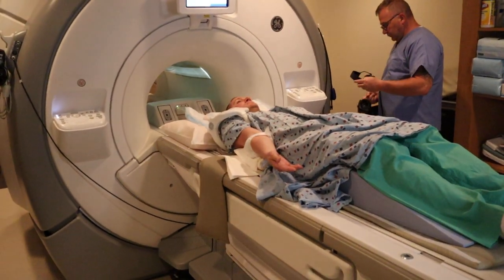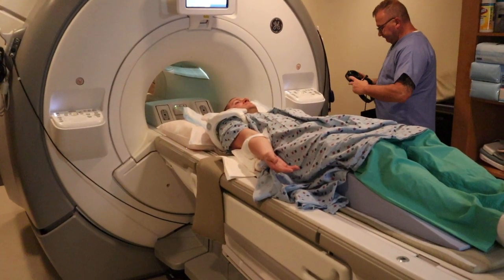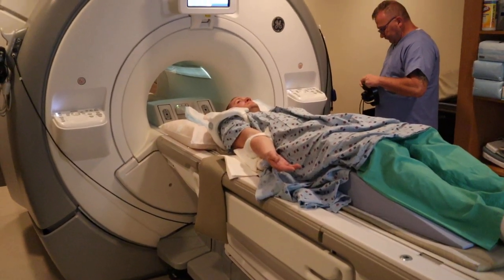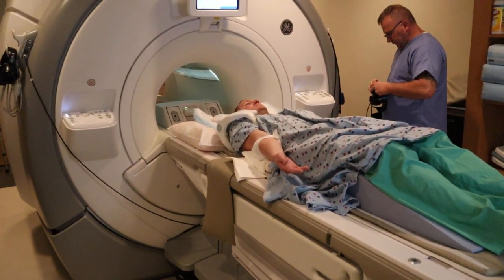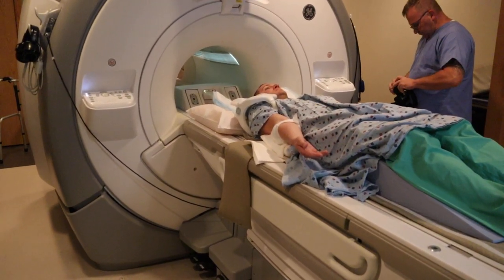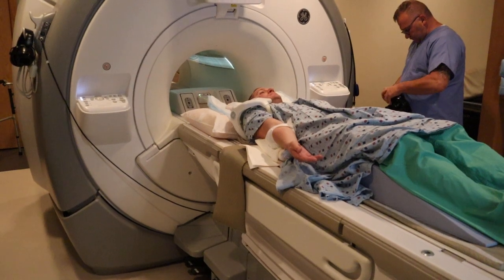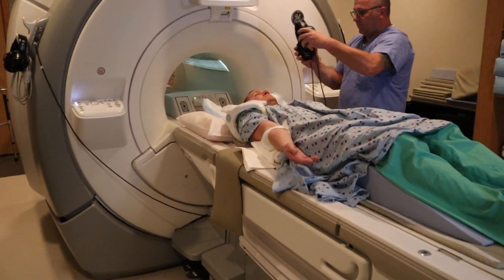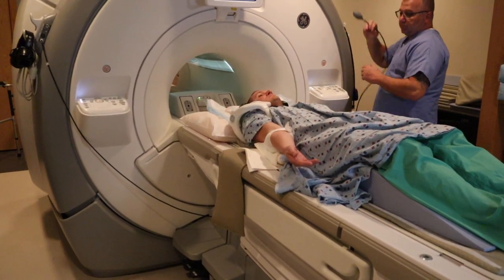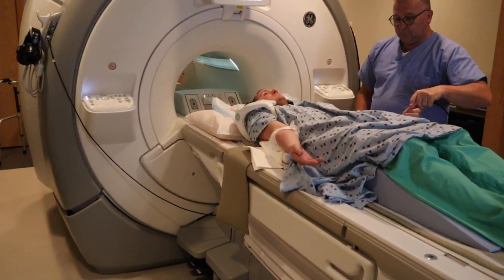Provide the patient with headphones. You want to give them earplugs and a headset. Place the emergency ball in the opposite hand.